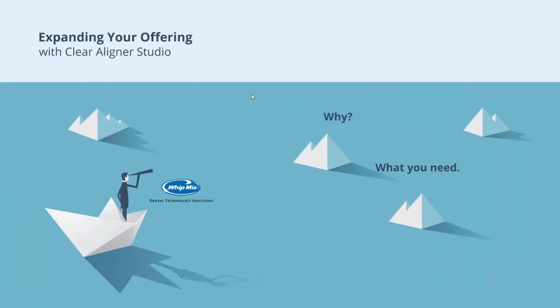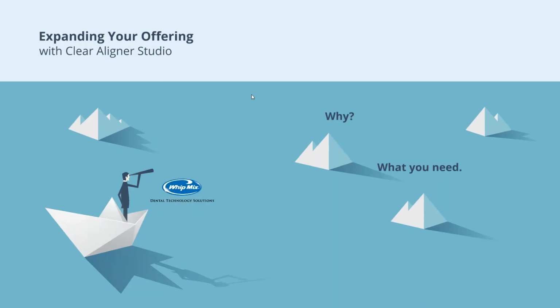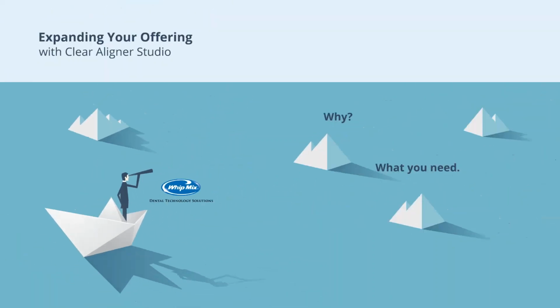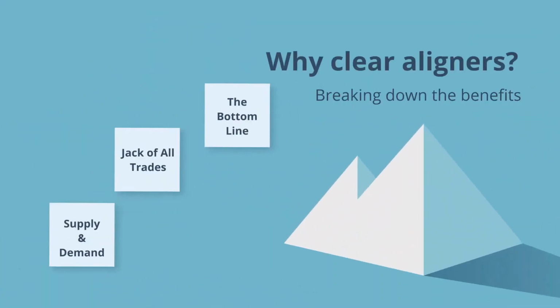So like Bernie said, we're going to be talking about expanding either your lab or your practice's offerings with Clear Aligner Studio. So the first question you might be asking is, why clear aligners? I'm sure you've all seen the Facebook ads of various home kits. Everybody obviously is already familiar with Invisalign. That's kind of like the big brand name.